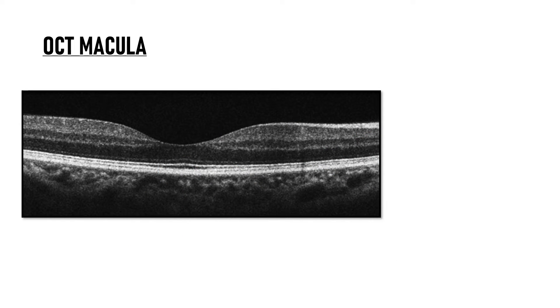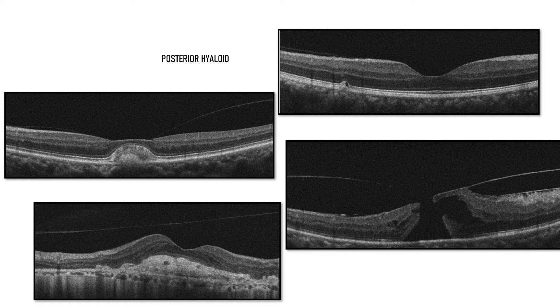The black area in front of the internal limiting membrane is the vitreous. Vitreous has zero reflectivity because it is a clear, optically transparent fluid. The junction between the vitreous and retina is known as the vitreo-retinal interface. The space in front of the macula is known as the pre-macular bursa. The posterior layer of vitreous is the posterior hyaloid, which is not usually identifiable but is visible in cases of posterior vitreous detachment — seen as a hyper-reflective membrane-like floating shadow either completely or partially separated from the retinal surface.